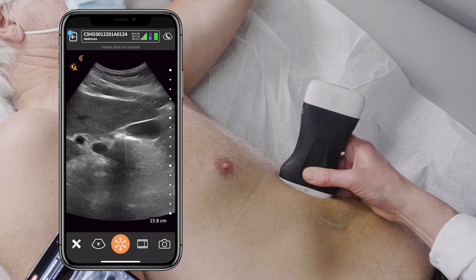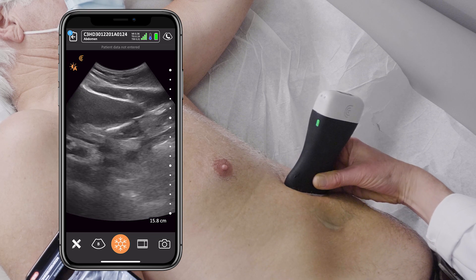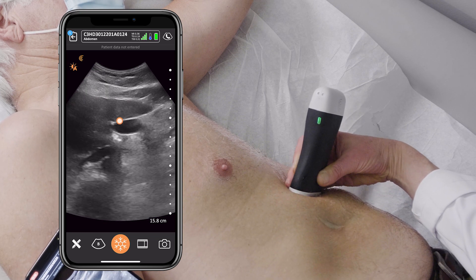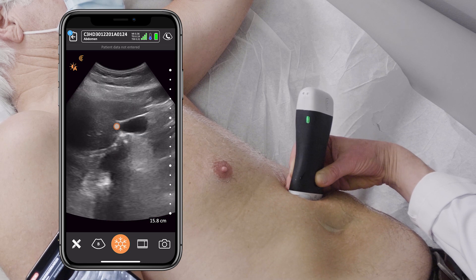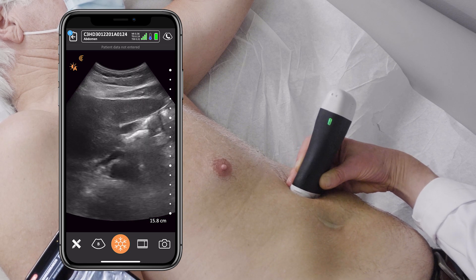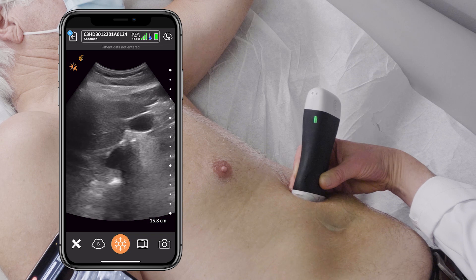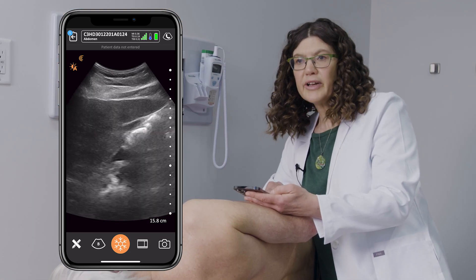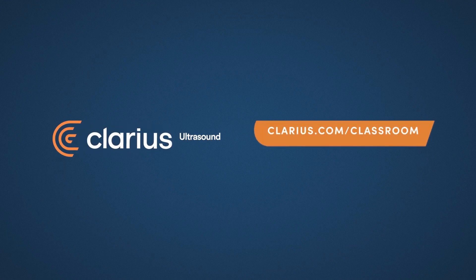I can then turn my probe in transverse and interrogate the gallbladder in a different plane. Once again, I don't see any stones. This concludes the gallbladder ultrasound.